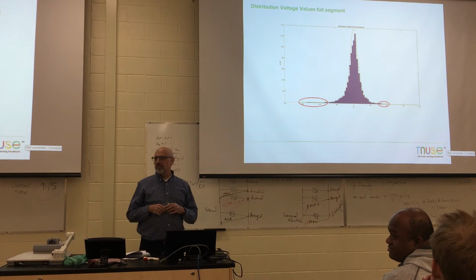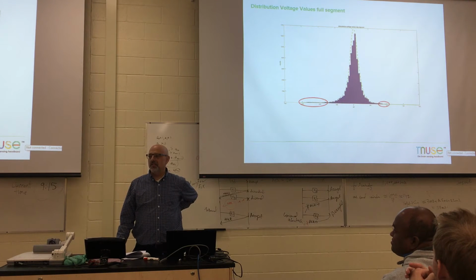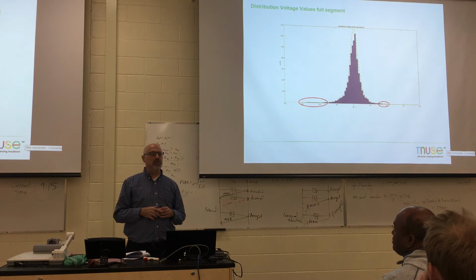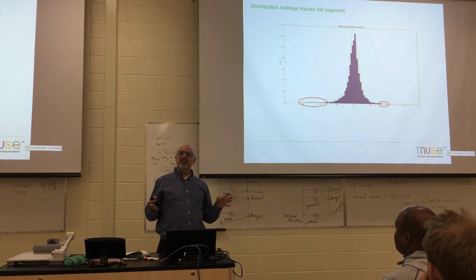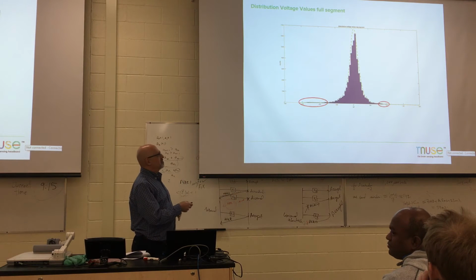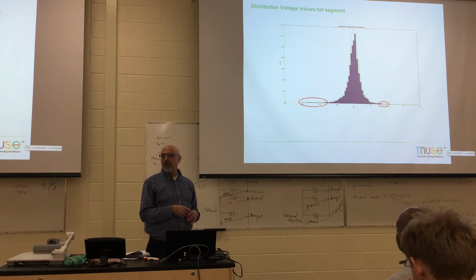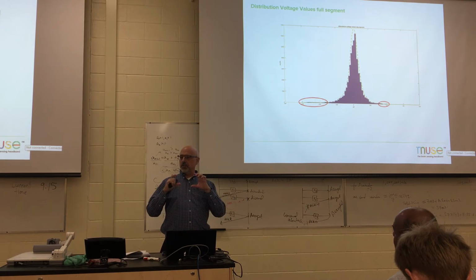So like you're saying, what function does that look like? Yeah, like a Gaussian. That's a Gaussian. So clean EEG voltage values, if you plot them in a histogram, will have a nice Gaussian distribution. But what's interesting here is that there are thicker tails. They didn't turn out to be as thick as I wanted for this illustration, but you can see that there are a lot of voltage values that are outliers, and kurtosis is a measurement of how thick your outlier tails are. So this suggests that maybe we can use kurtosis as a way of measuring whether this is clean EEG or whether there is some kind of contaminating artifact in it.